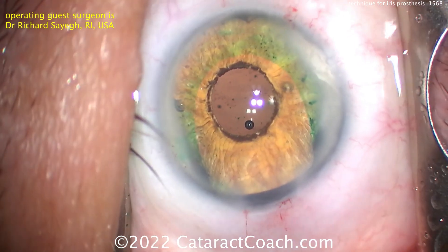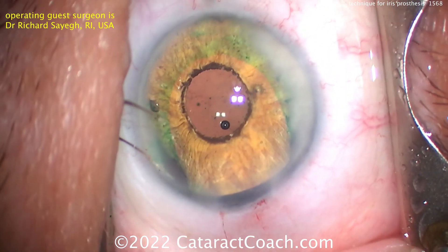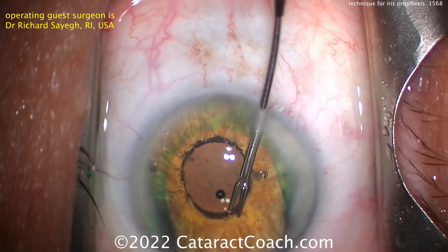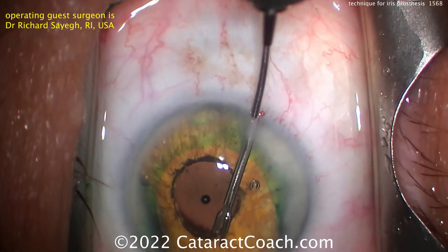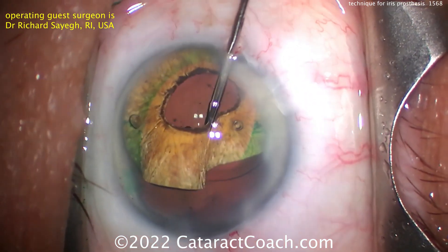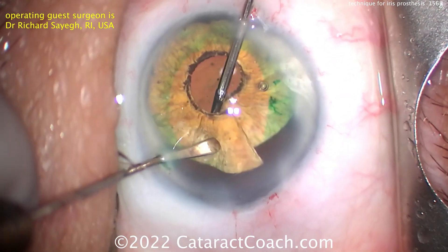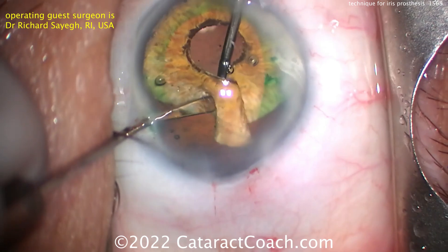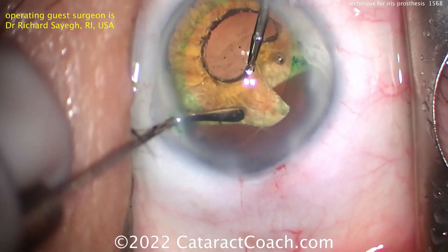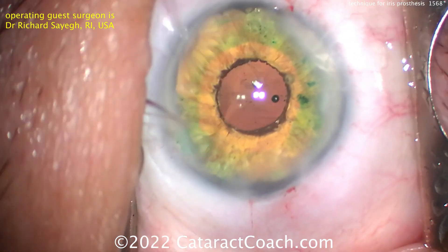There are techniques like the paper from Dr. Henrique showing the fold-over technique. A lot of good videos and information out there. We had a CataractCoach video a few weeks ago showing a different surgeon's technique. Here's where you pull it back and fold this thing over — the fold-over makes its overall size a little smaller. Now we can go into the capsular bag — underneath the bag, open it up. Beautiful-looking result.